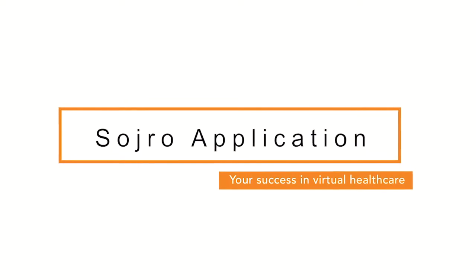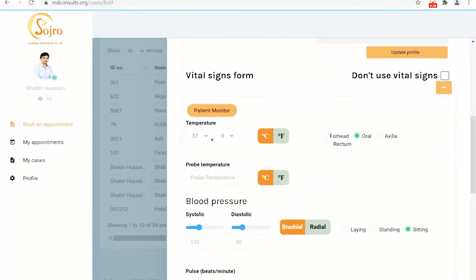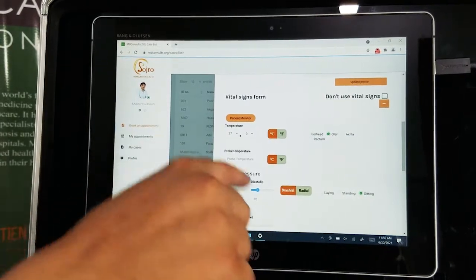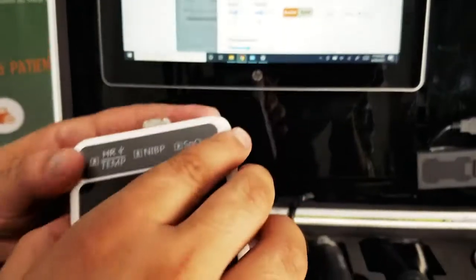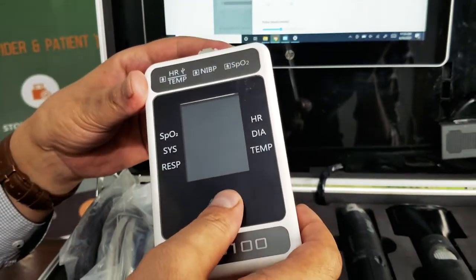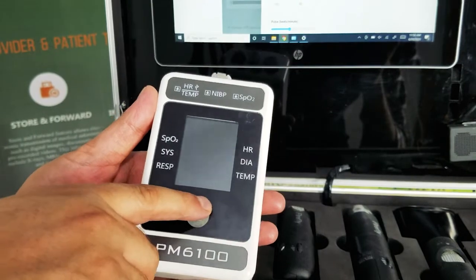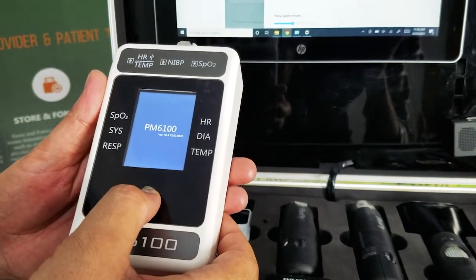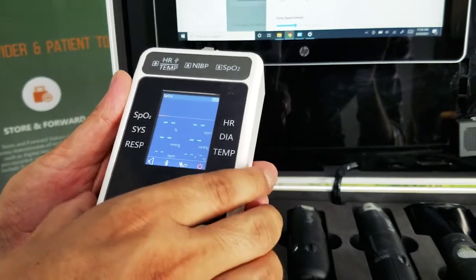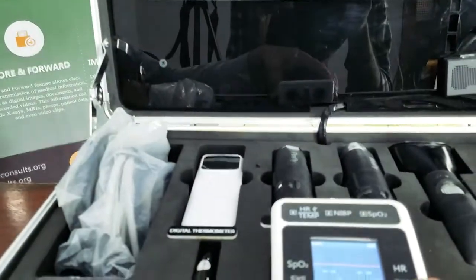During a live consultation with a new patient, they can measure vital signs using the vital signs monitor. You can turn it on and hook up the vital signs monitor with your tablet. Once the vital signs monitor is turned on, a Bluetooth indicator starts beeping.